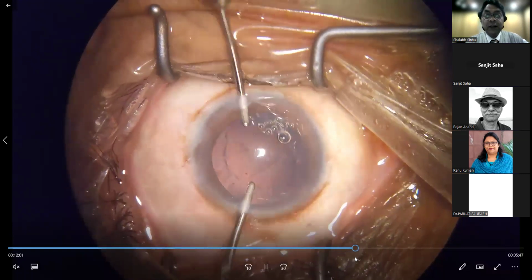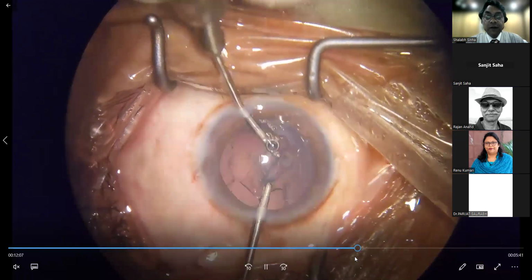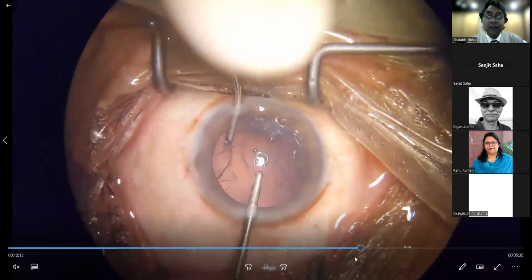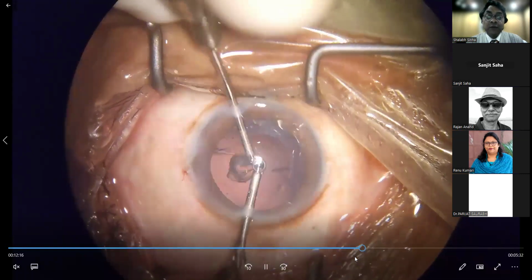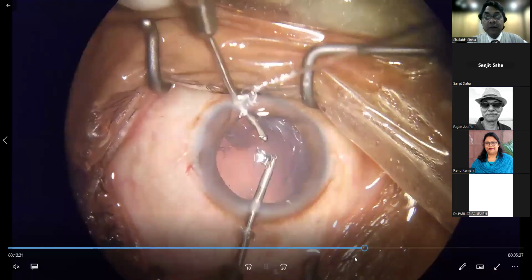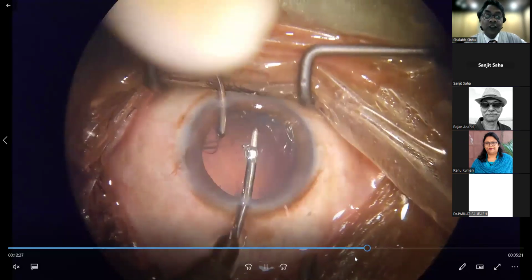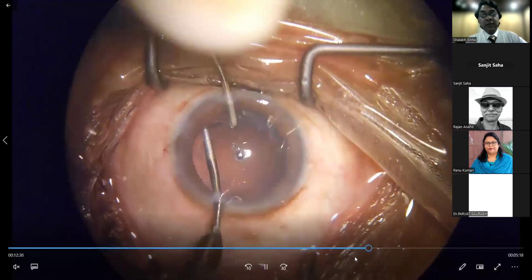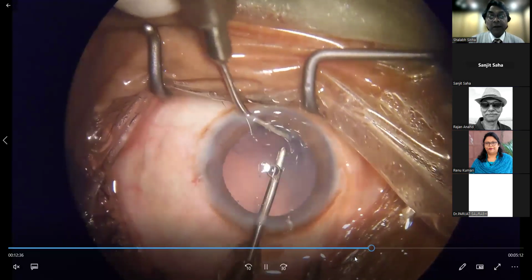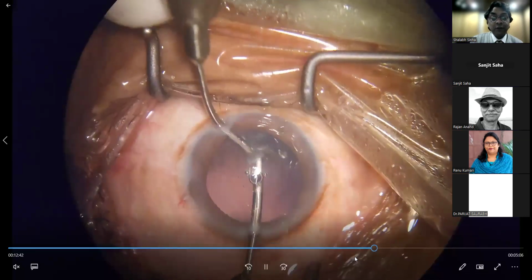So irrigation in the right hand and aspiration in the left. A little bit of tugging it sideways to release it, and always it is brought to the center and then aspirated. And generally, if I can, I don't change my hands. I just keep the irrigation just behind the aspirating port so that it protects the posterior capsule from jumping up.